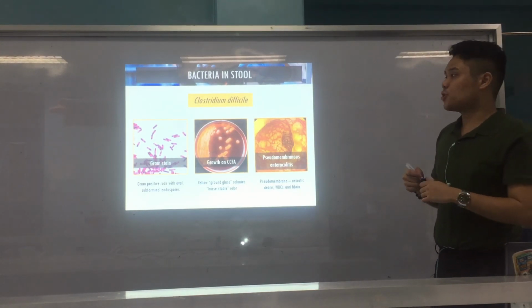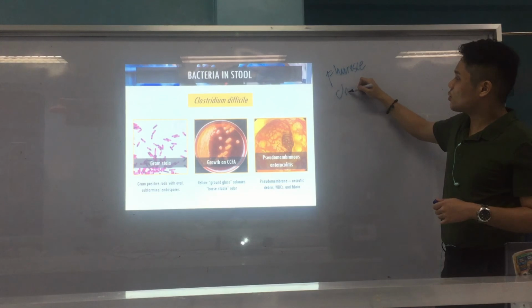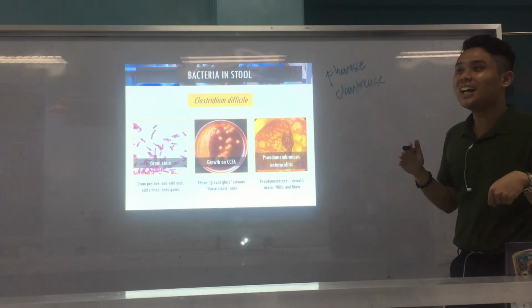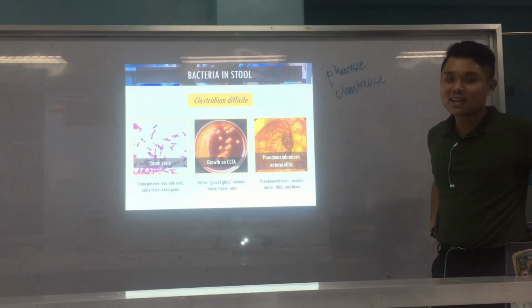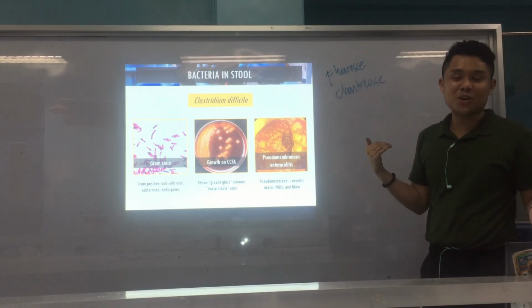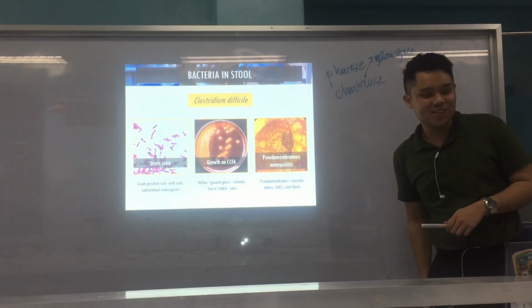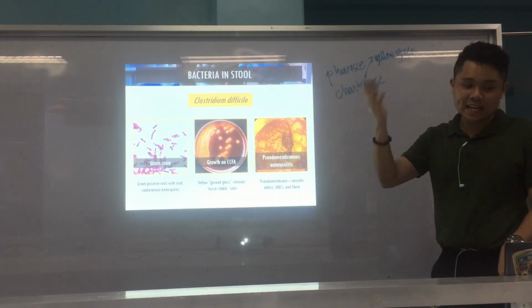And another characteristic there of Clostridium difficile is fluorescence. Fluoresces siya og chartreuse. Familiar ba ning chartreuse, guys? Di ba sa Miss Universe, si Miss kinsa to siya? Nalimot ko iyang name. Katong iyang favorite color kay chartreuse. Ang chartreuse, ang color niya, actually, yellow-green. Yellow-green na siya, guys. So, fluoresces siya o chartreuse or yellow-green, ang Clostridium difficile. Again, it's an anaerobe.